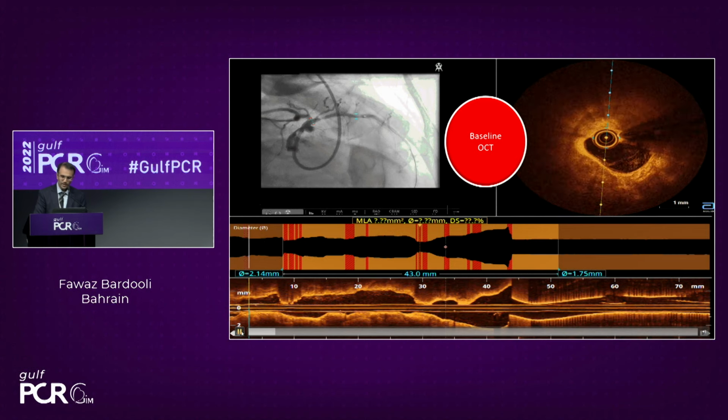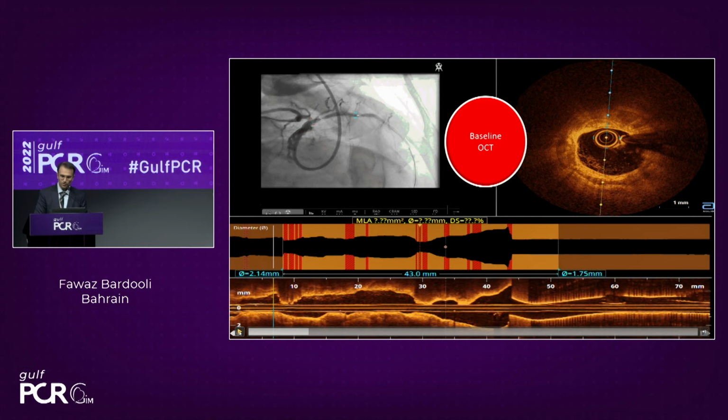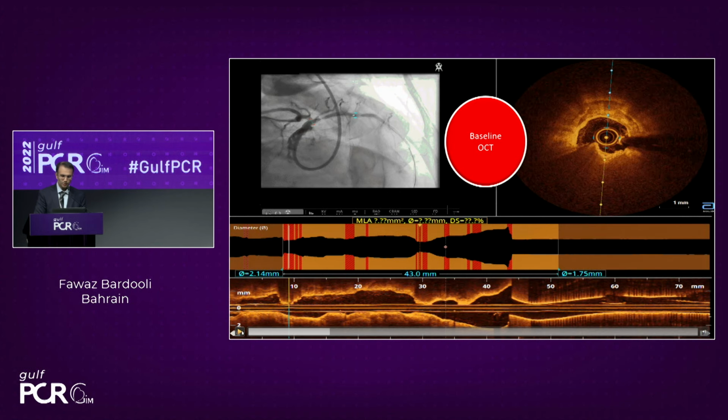From distal, you can see the amount of calcification with different types of calcification, eccentric and concentric. At this level, I want you to look carefully between around 8 or 9 o'clock till 12, and see what you are going to see. There is something protruding from this area, a type of calcium that is a calcified nodular calcification with an irregular surface.